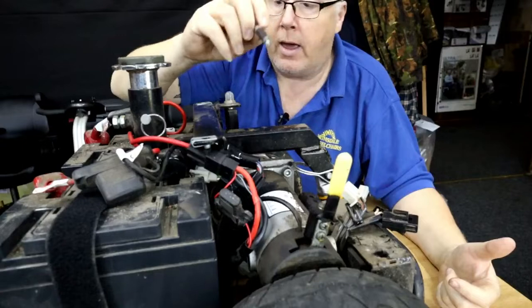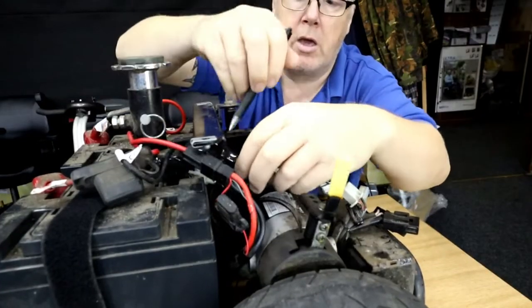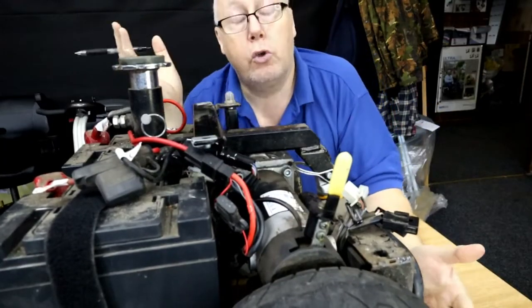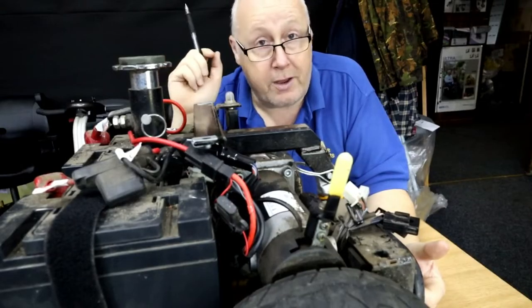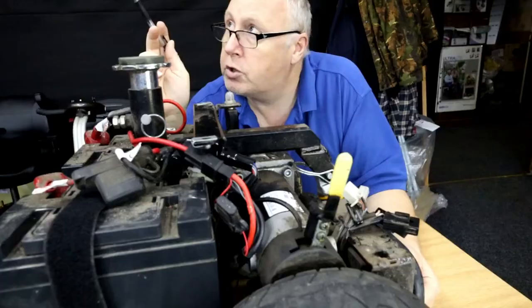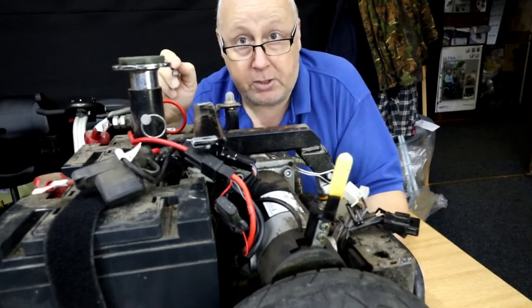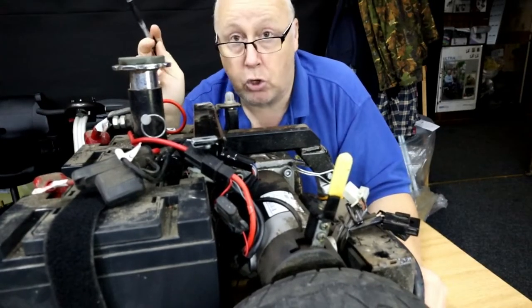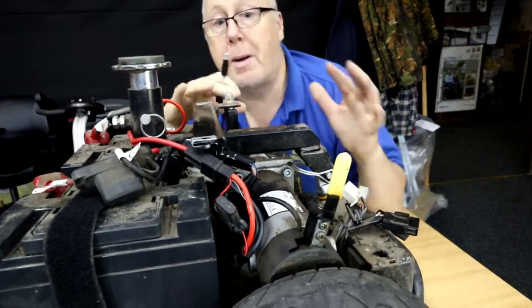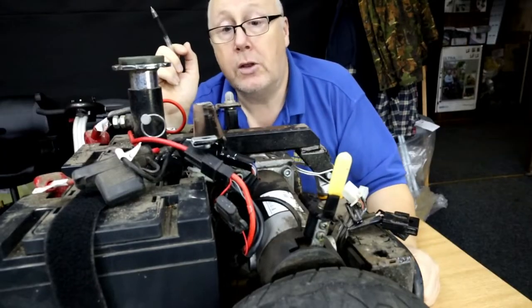I can't see any broken wires, and power is getting up there. We've got a connector here that we can check - it has been moved by the looks of things. You could also check the ignition switch at the top to see if power is getting there. If there's no power at the ignition switch, you work your way back. In this case the wires go from here to the charging socket - it's an individual circuit on this particular scooter.